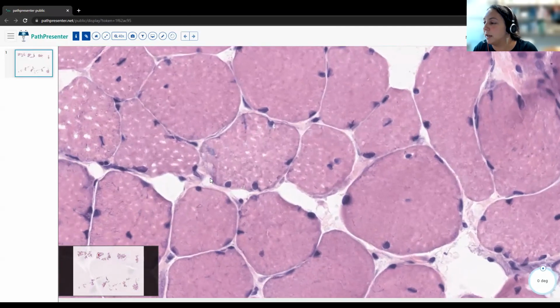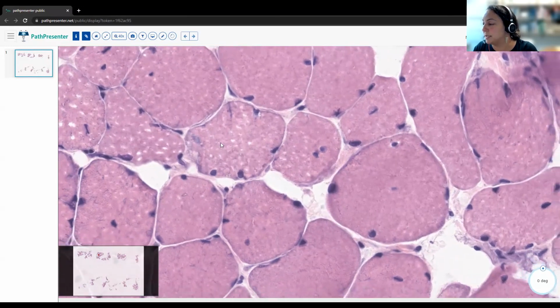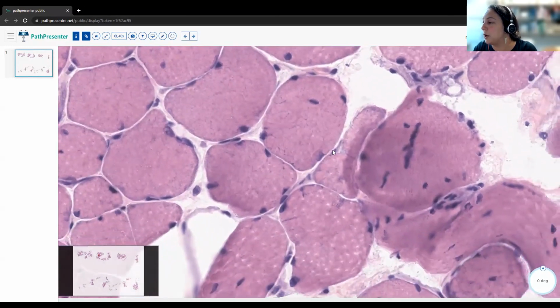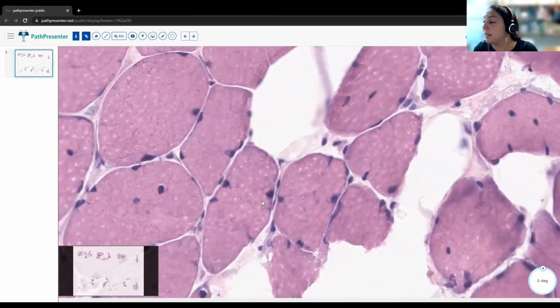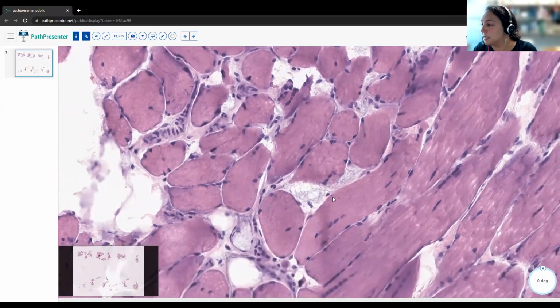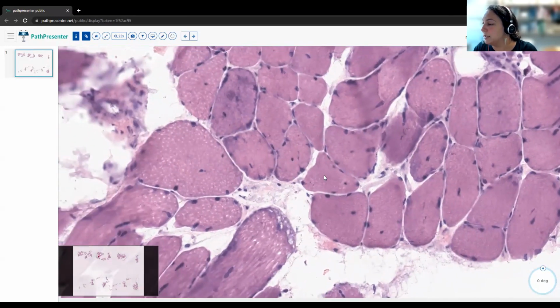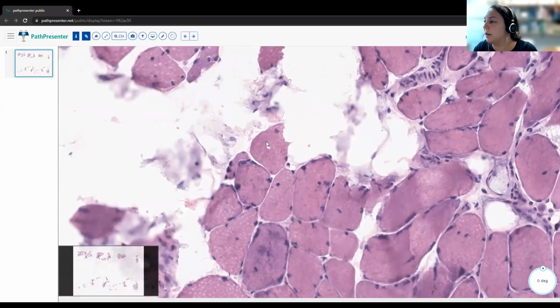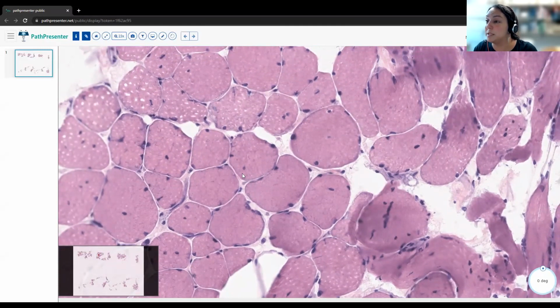But then very subtly, similar to what we were seeing in one of our nemaline myopathy cases, it looks like there might be a little bit of something odd here in the subsarcolemmal space, a little bit of clearing. Maybe there's something that's going to be present. Whenever I see that, I really jump to my trichrome. I want to know what's going to be in that space. Is there anything that's going to be helpful in that space? And then seeing a lot of increased internalized nuclei is also an interesting finding when we're thinking about a congenital myopathy, and you can see that they're lining up here in chains. So this is very concerning for a congenital myopathy, not only based on the clinical history, but also now based on what we're seeing under the microscope.